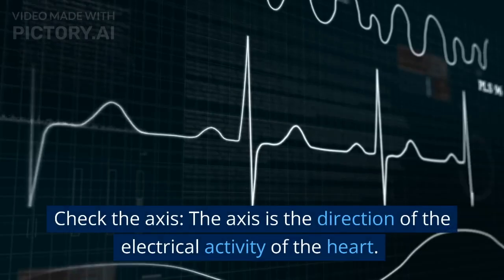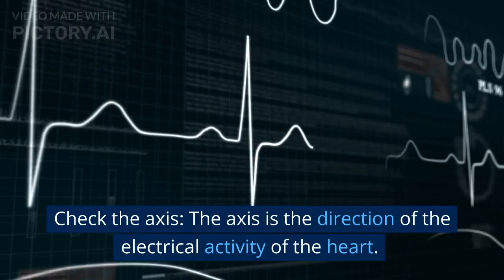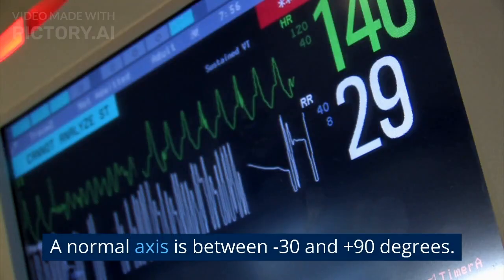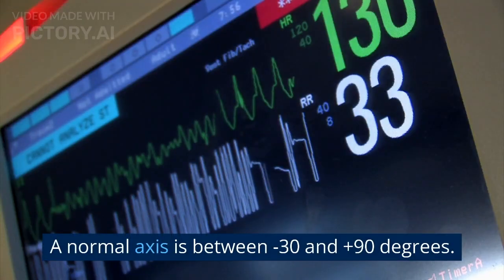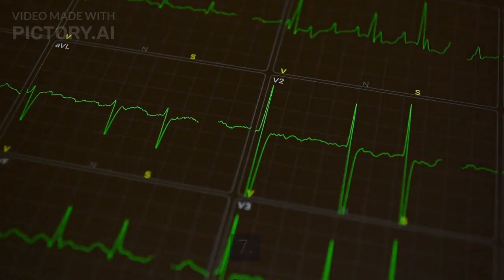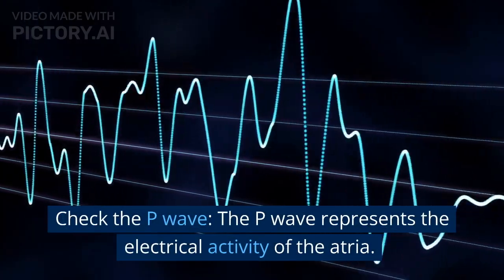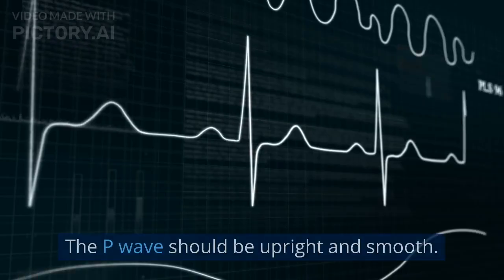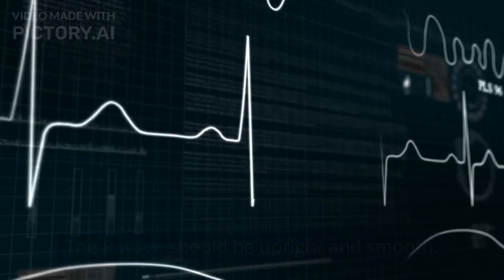6. Check the axis. The axis is the direction of the electrical activity of the heart. A normal axis is between -30 and +90 degrees. 7. Check the P wave. The P wave represents the electrical activity of the atria. The P wave should be upright and smooth.